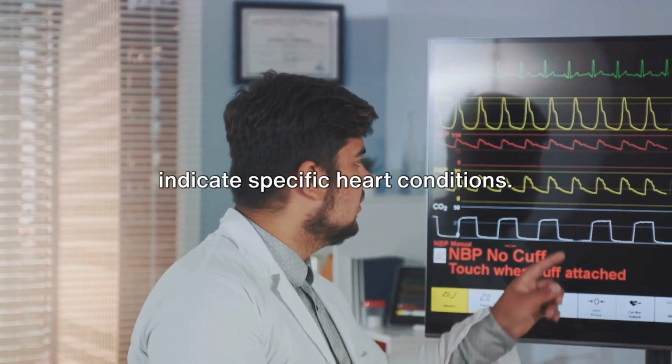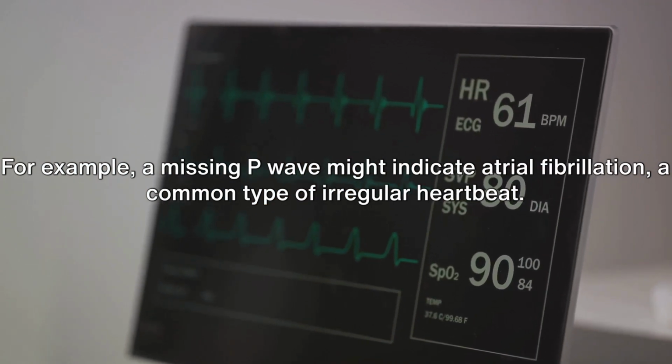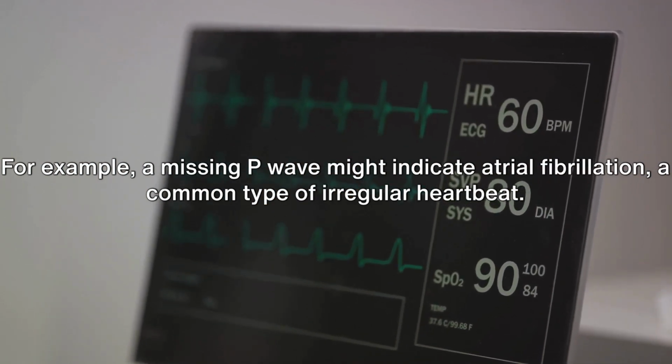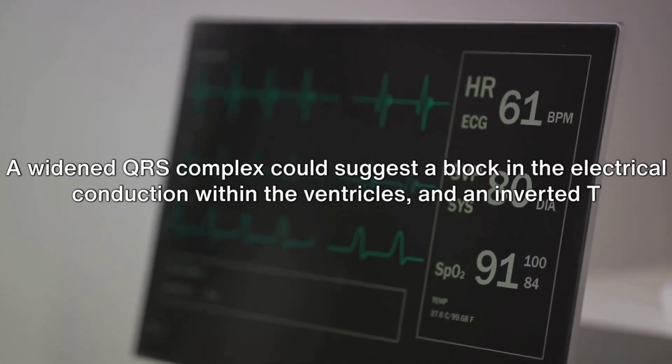indicate specific heart conditions. For example, a missing P wave might indicate atrial fibrillation, a common type of irregular heartbeat. A widened QRS complex could suggest a block in the electrical conduction.